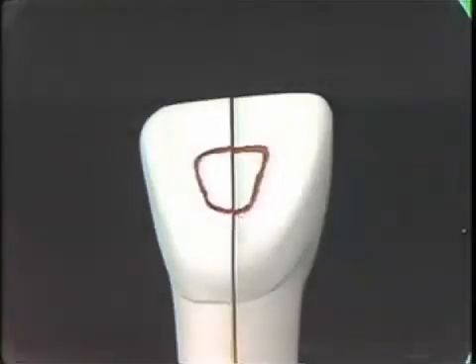In the clinic, the first thing that you would do before access preparation is to swab the tooth in the area with tincture of Merthiolate. Here, working on the model, we'll skip that step.